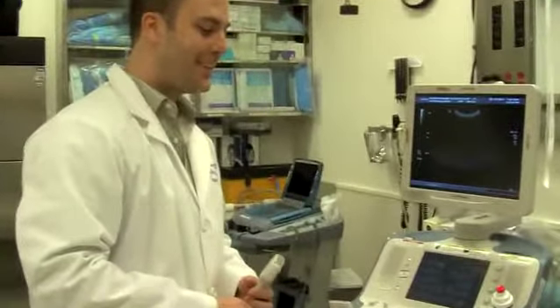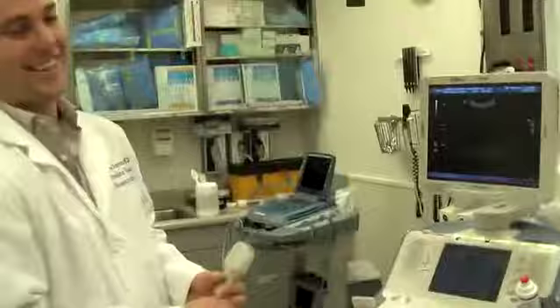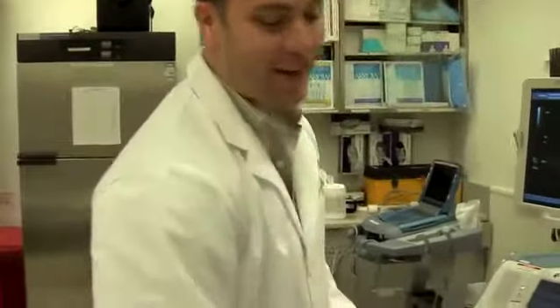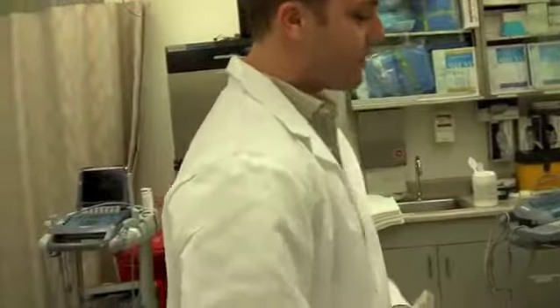All right, let's go. Gallbladder. Okay, so the next study we're going to teach you, we're going to give you a quick crash course on the gallbladder because it can be a somewhat difficult study, and we're more than happy to work with you, and the faculty is more than happy to work with you at any time on shift to help you make your gallbladder scans better. It's always nice when you're going to scan a patient's gallbladder to get nice clean towels and tuck them in so they don't get a bunch of sticky jelly all over their clothes.